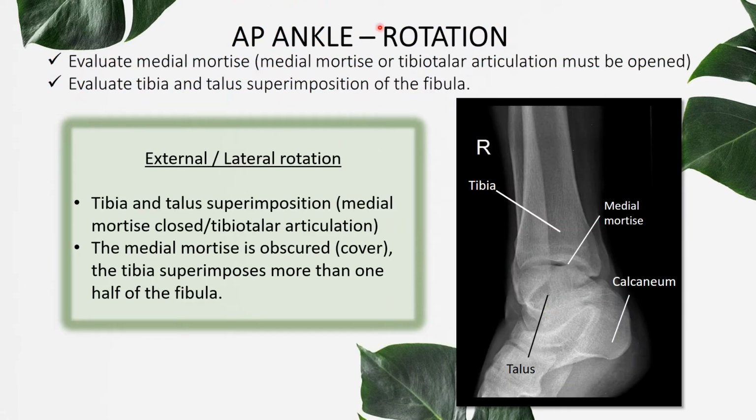The next rotation is external, or lateral, rotation. This radiograph shows external rotation. As you can see, we must evaluate the medial mortise, which must be open.